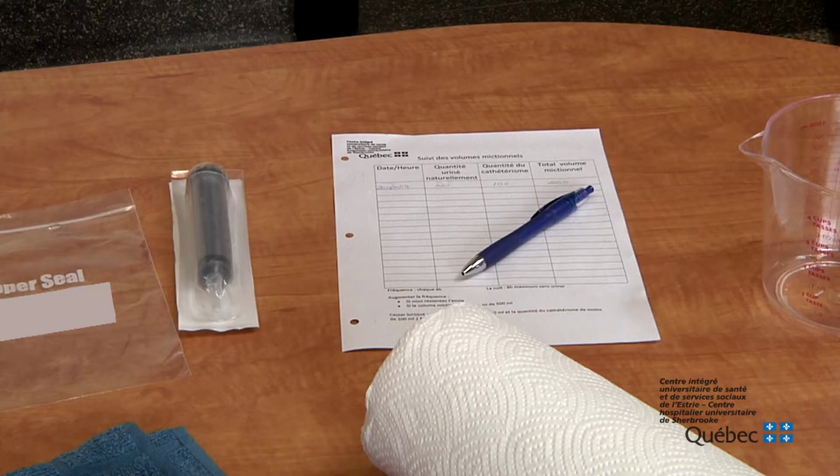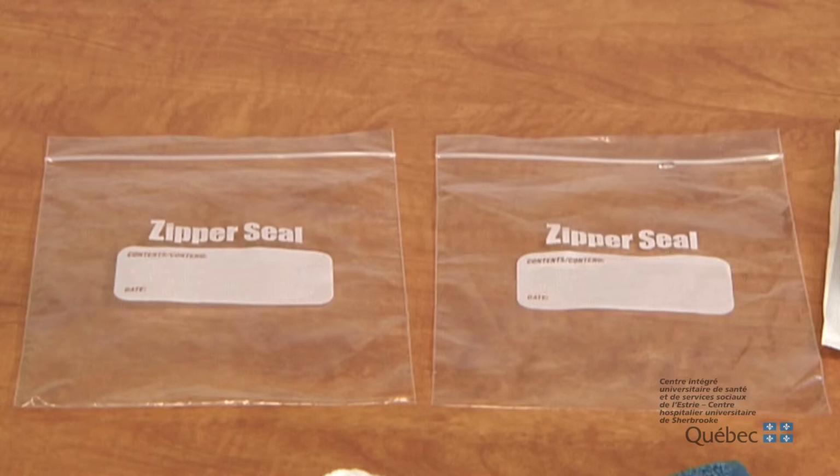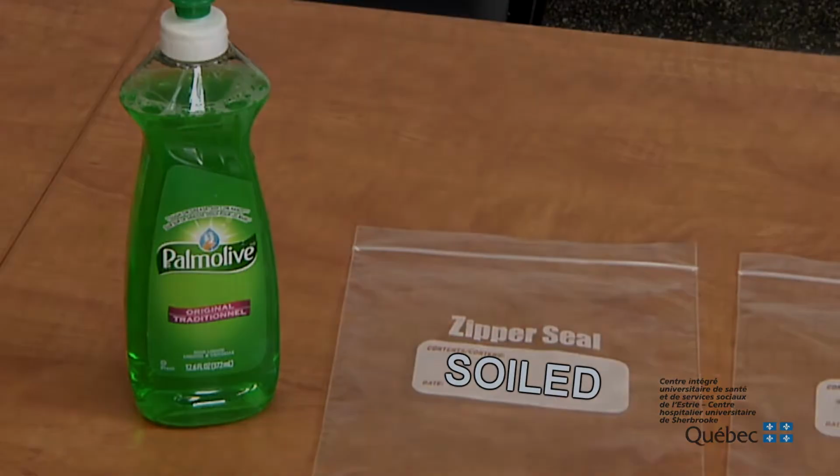Syringe with a catheter tip. You can ask your nurse for one before your discharge. Otherwise, you'll need to buy one at a pharmacy. 2 plastic storage bags of the Ziploc type. Mark one soiled and the other one clean. And finally, dishwashing liquid.